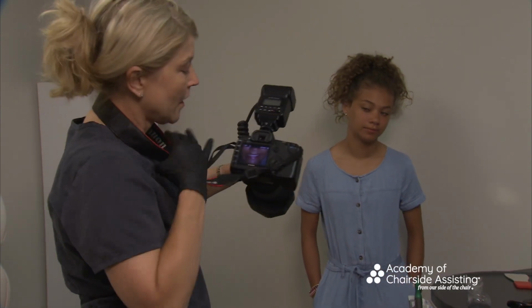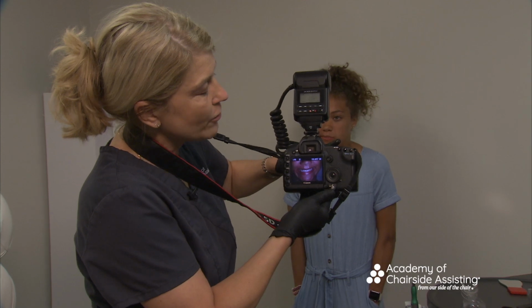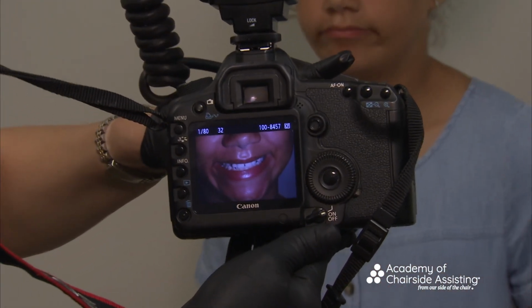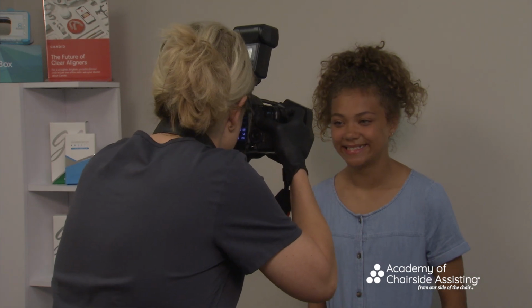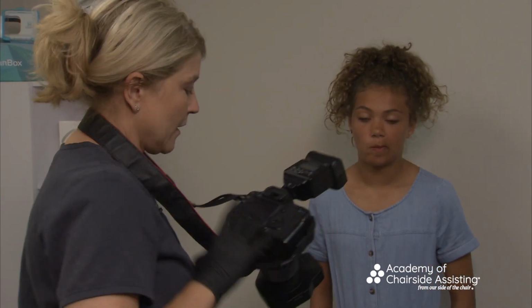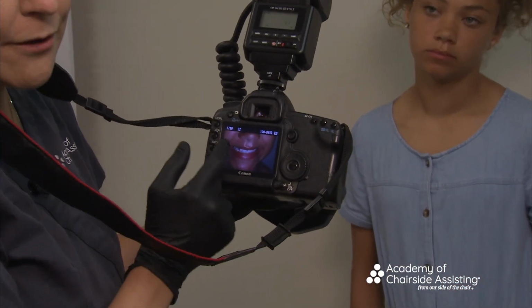Now, I want you to come in close here because I want you to see what happened. She's ever so slightly canted. Because why? She's got a habit of doing that, right? You saw. I love it because this way I can show you some of the troubleshooting you want to think about. Beautiful. And so I'll share with you that, again, she's got a tiny mouth.